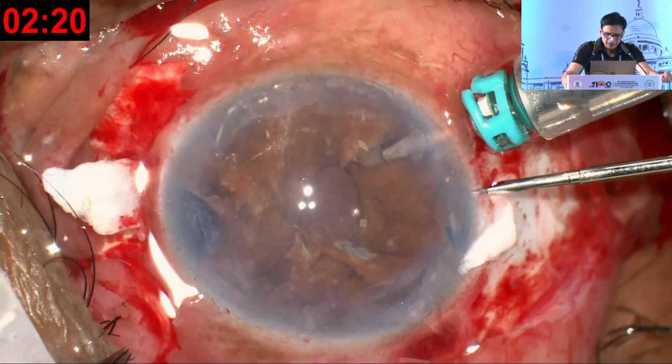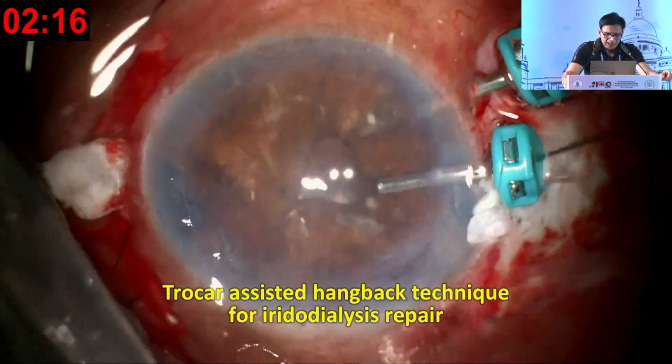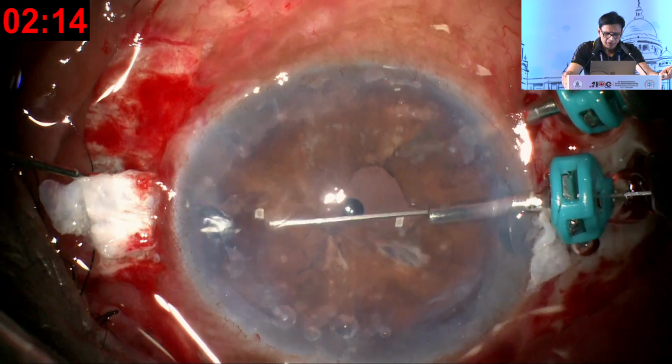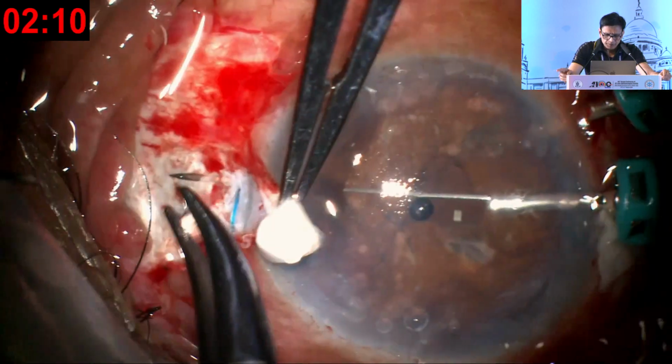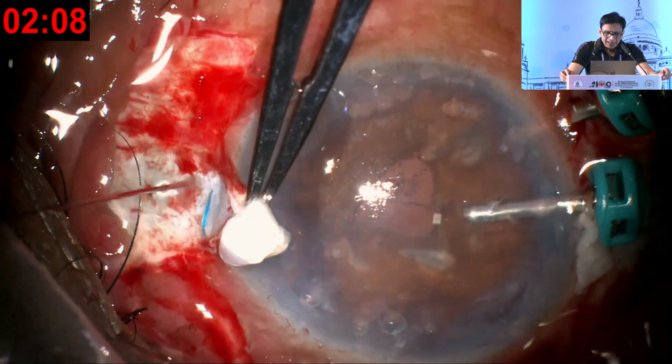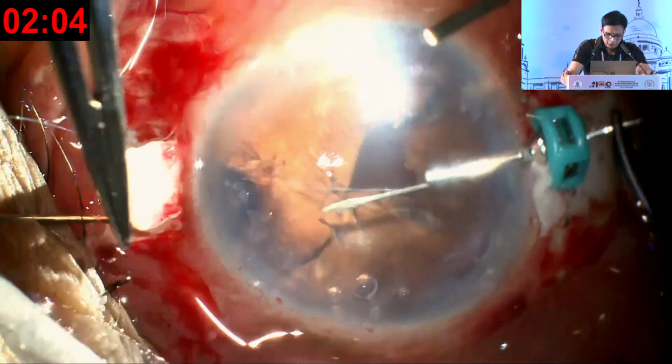Once you have done that, look at the Purkinje image. As I said, that's extremely important. Now you notice there's a dialysis which I've created by mistake on the other side. So I fixed a trocar opposite it, and I'm going to fix that iridodialysis. So now this is the trocar assisted iridodialysis.